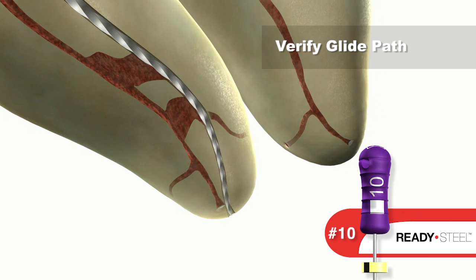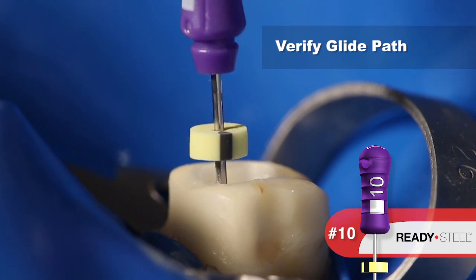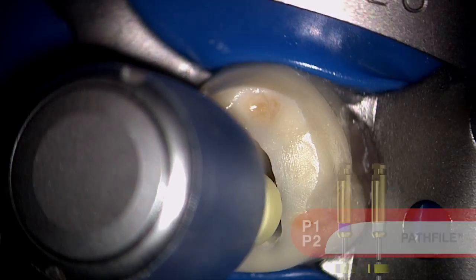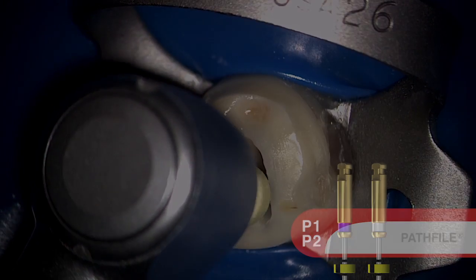Once the instrument is loose and we have confirmed working length and patency, we need to verify the glide path. The glide path is verified when a 10 file can slip and slide easily and reproducibly over the apical 1/3 of the canal. Now expand the glide path using a 15 hand file or an equivalently sized dedicated mechanical glide path file.